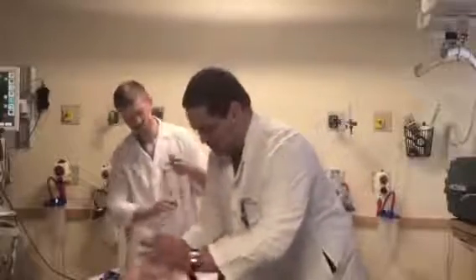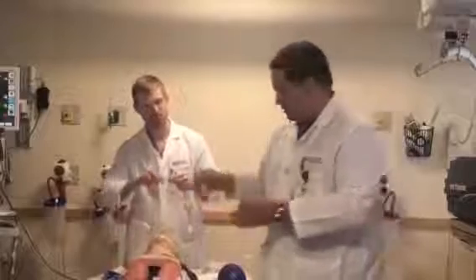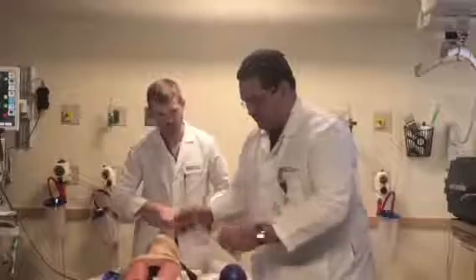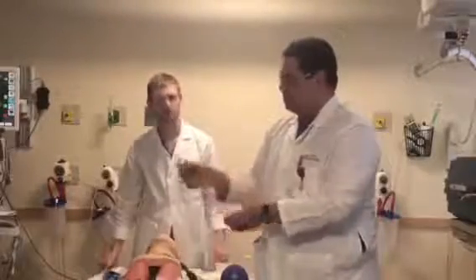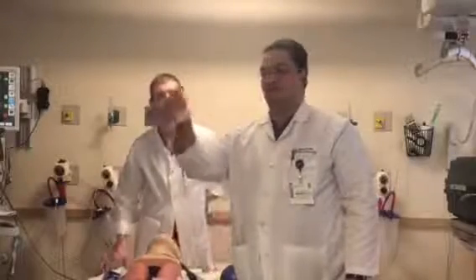This is a kit that we made. It's in the difficult airway card, so people don't have to look for it. Let's say we place this using a needle. You remove the needle, and this is inside the larynx like this. Our central supply makes it for us.